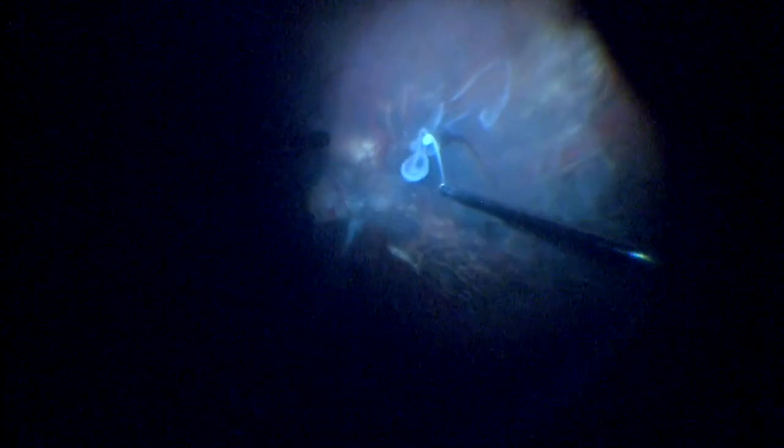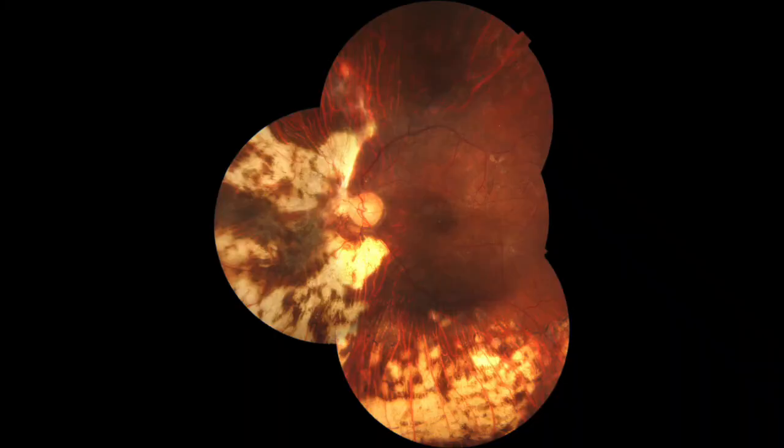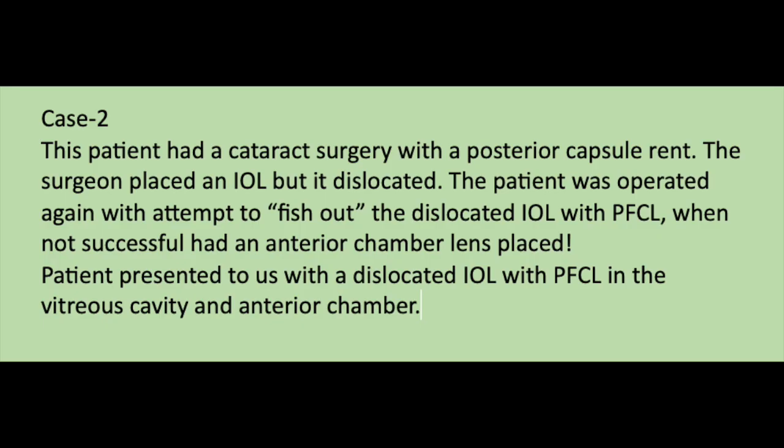and trying to release or mobilize the inferior retina which had detached by using triamcinolone. Once having done that, I put in silicone oil after having got an attached retina and did more endolaser. I could get an attached retina and after removing of silicone oil, I have a follow-up of now about 18 months. It's an attached retina with 20/60 vision.